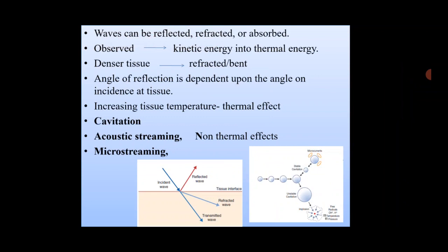So, ultrasound has two physical properties, that is thermal effect and non-thermal effects. Thermal effect is the increase in tissue temperature. Non-thermal effects are cavitation, acoustic streaming and microstreaming.